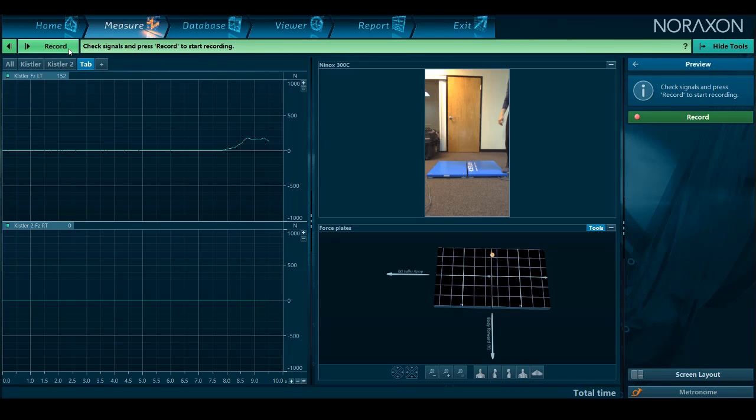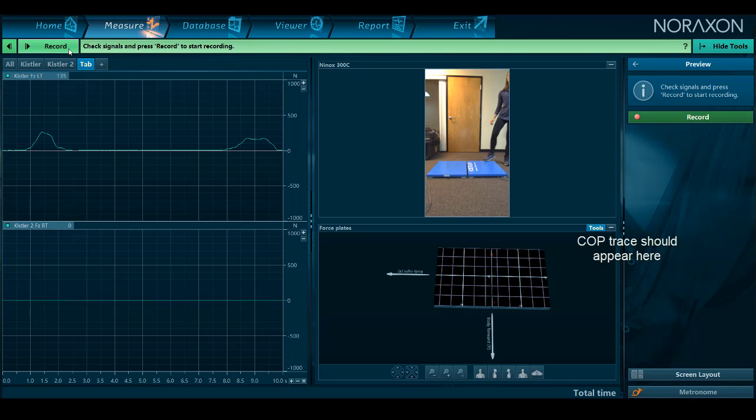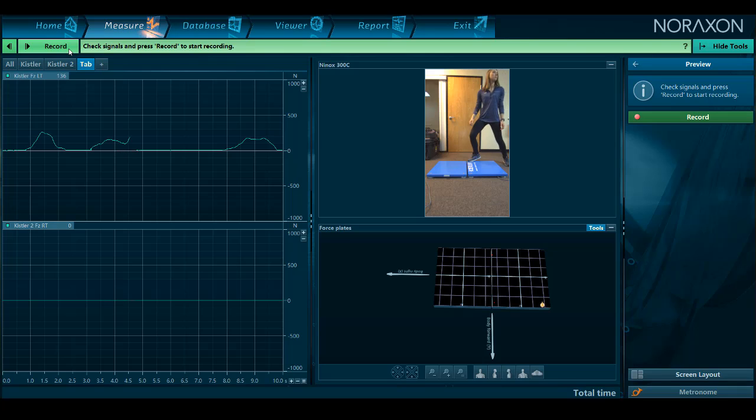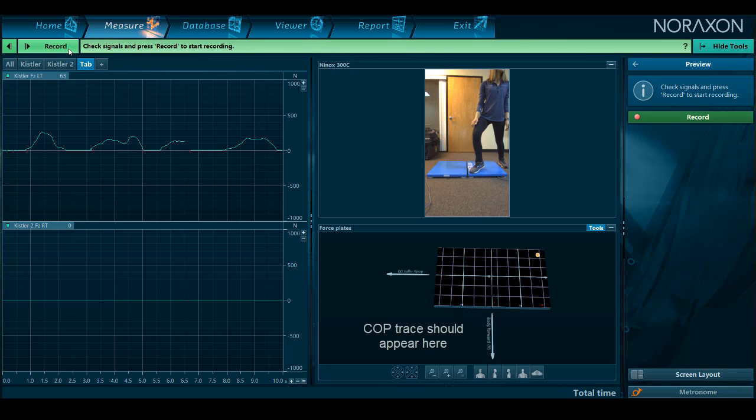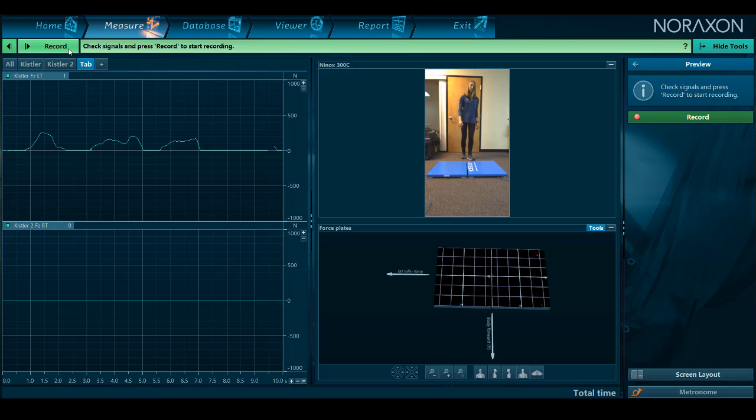Tap the corners of the force plates with your foot to see where the COP trace appears. If it appears in the opposite direction, you may need to change the plate to the opposite direction back in the configuration.